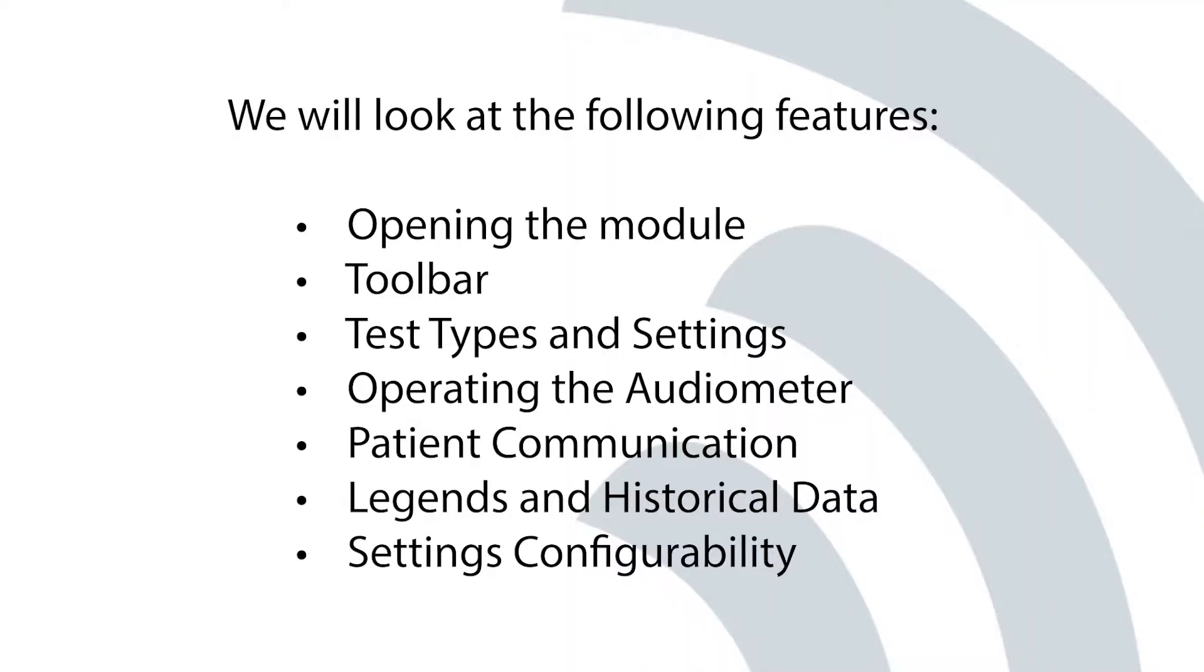We will look at the following features: Opening the module, Toolbar, Test Types and Settings, Operating the Audiometer, Patient Communication, Legends and Historical Data, and Settings Configurability.